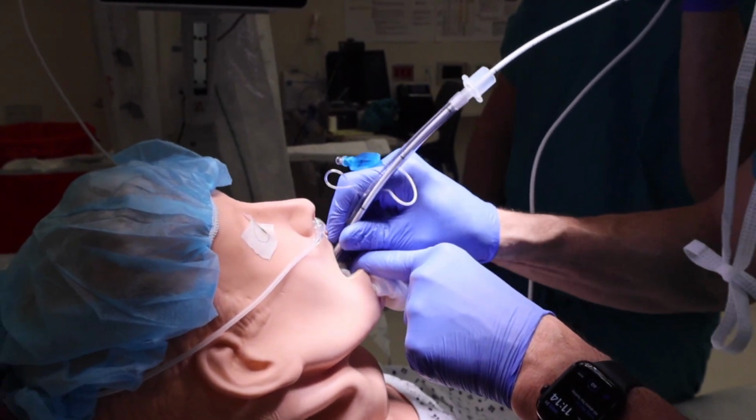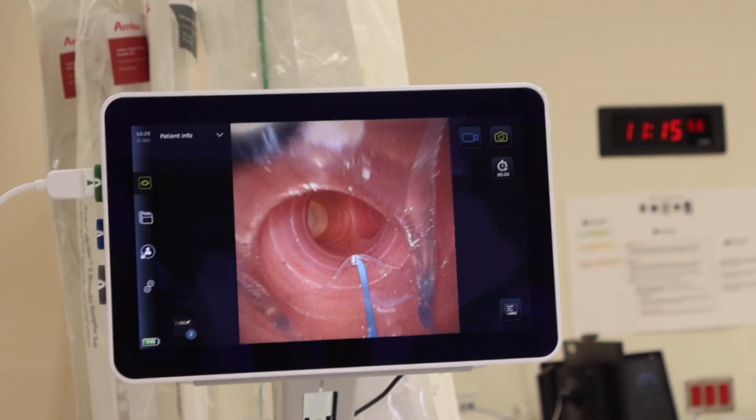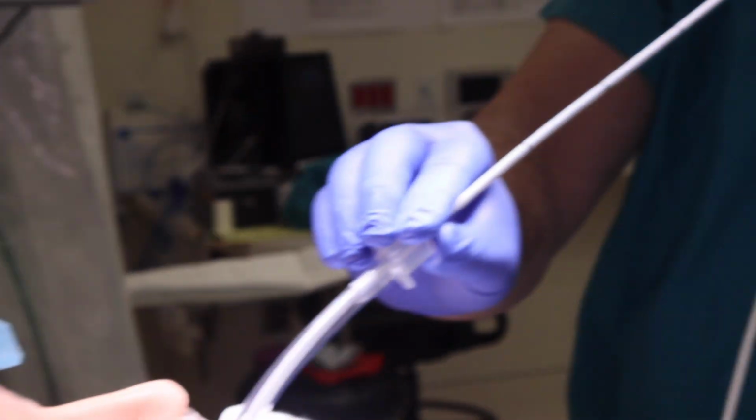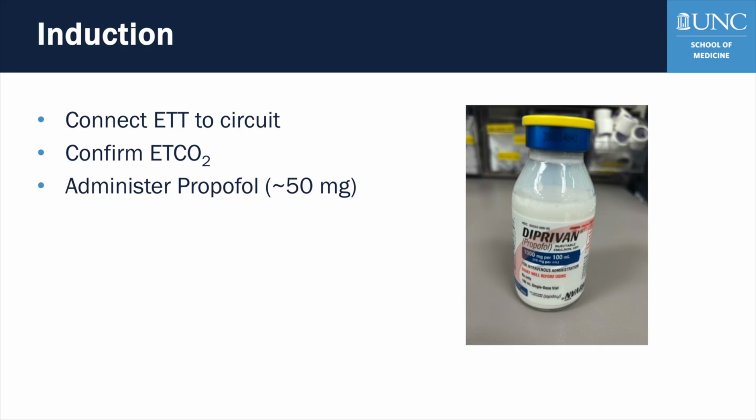Again, time advancement with an inspiratory breath. Confirm tube position by visualizing rings around the tube tip. Then remove the scope while stabilizing the endotracheal tube. Once the airway is secured, reassure the patient, confirm end-tidal CO2, and proceed with induction, often using a reduced dose of propofol, given the ongoing dexmedetomidine and remifentanil. After turning the patient supine, secure the tube and ensure hemodynamic stability.